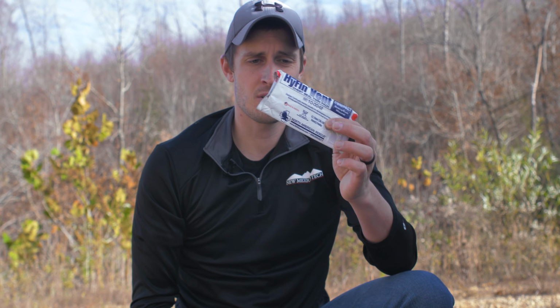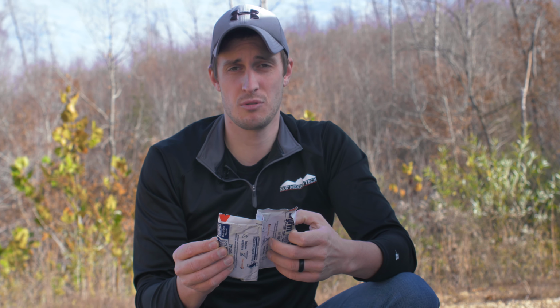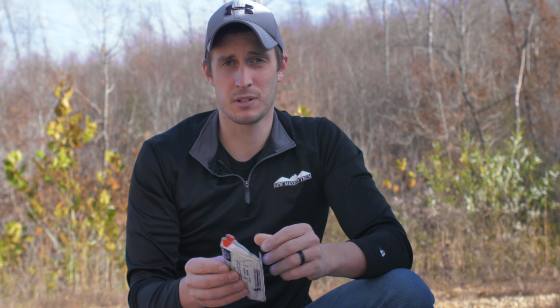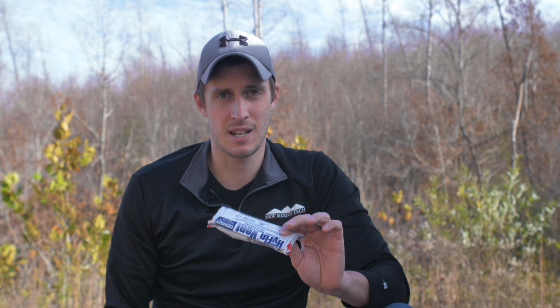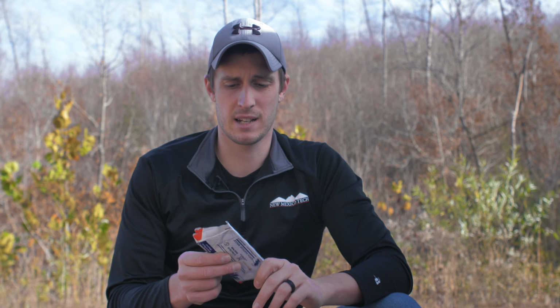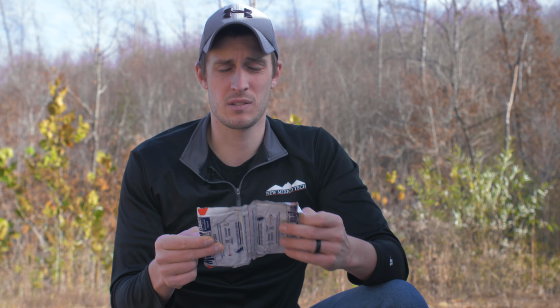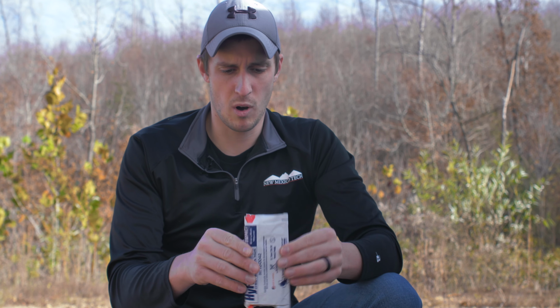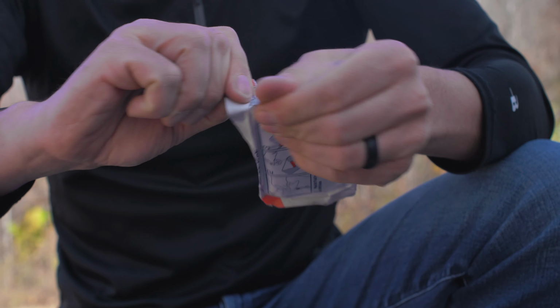All right, now the ones that I've been carrying with me almost every single day for the last 2 years. These have been in my ankle kit, and they have sat in the car a decent amount, not an extended month or two or whole summer, but from time to time when I'm wearing other ankle kits or wearing shorts and I have stuff in my pockets, I will leave these in my glove box in my truck. So they have been exposed to some heat, but they've also been wadded up inside of an ankle kit wrapped around my ankle for a while. So let's see how these look.